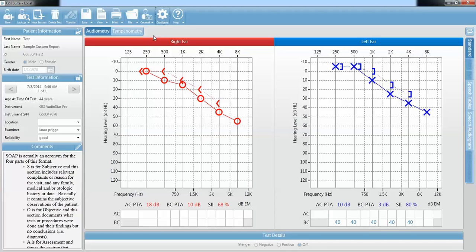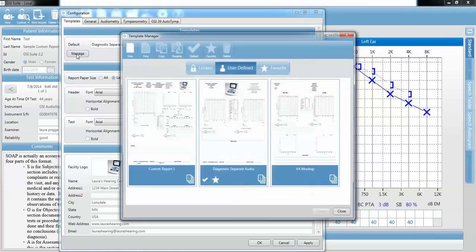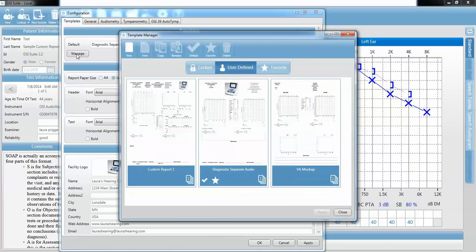To customize your report, you will go to the Configure icon, you will go to Templates, and then you will go to Manage the Templates. When you press Manage, it's going to pull up a window called the Template Manager.